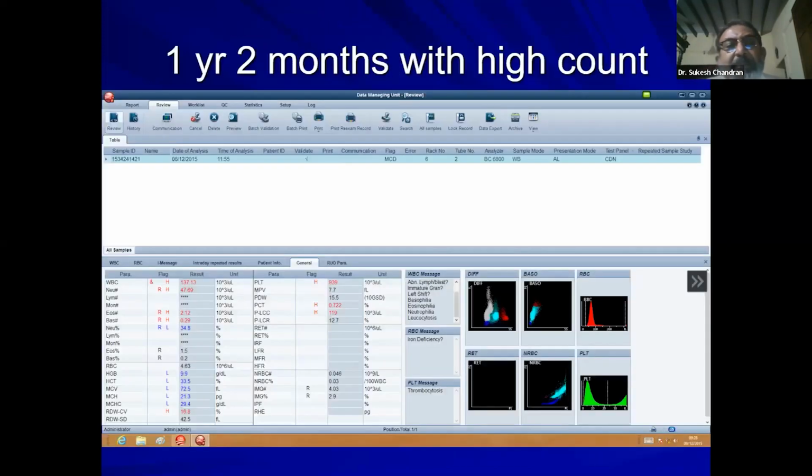This is an incident that happened, I think, 5 years back. We have done a study with that. A pediatric hematologist, infectious disease person, told me that there's a patient with him with high fever who is 1 year 2 months old. Your registrar has reported blasts. Can you look at it and tell me?